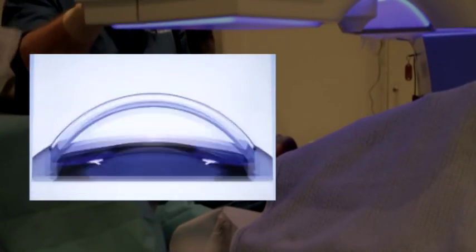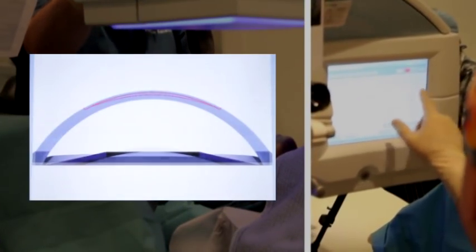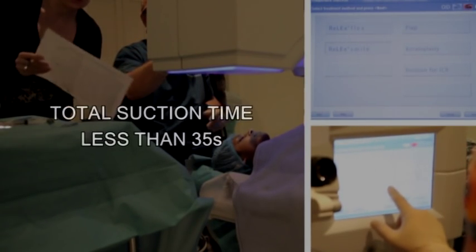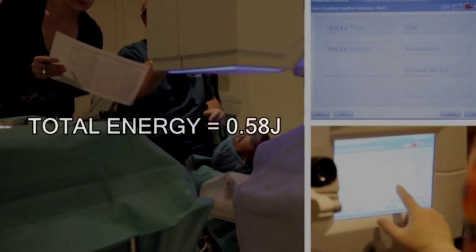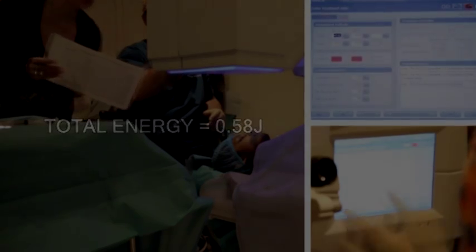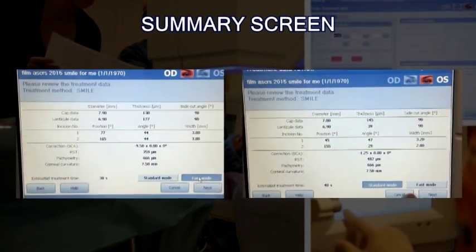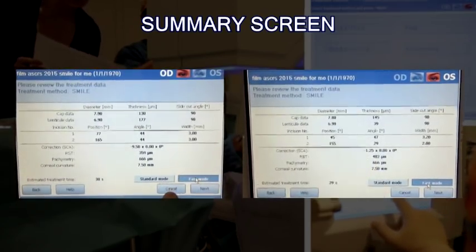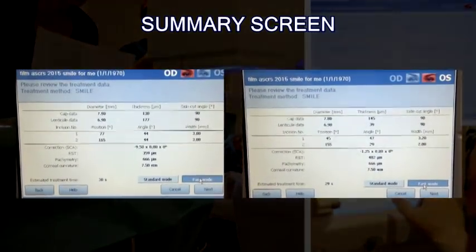Cap and lenticule parameters along with the size and number of incisions are programmed in the laser. The total suction time is less than 35 seconds and the total energy is 0.58 joules. These do not vary according to the refractive treatment because the laser always uses the same incision parameters but simply places them farther apart for higher corrections.